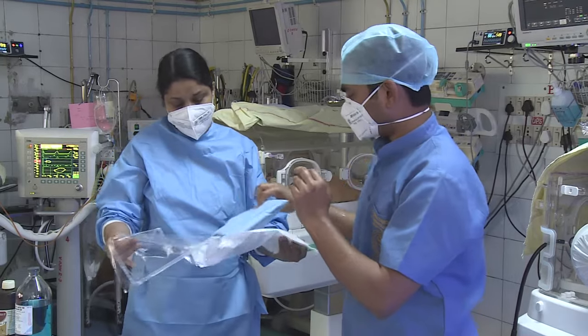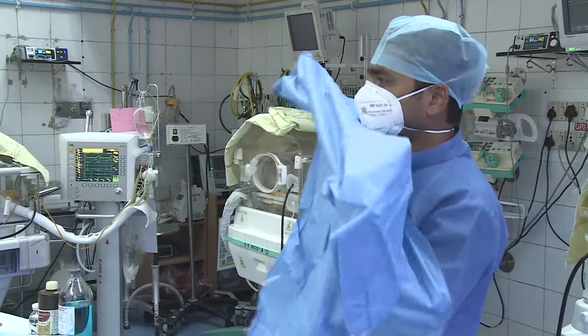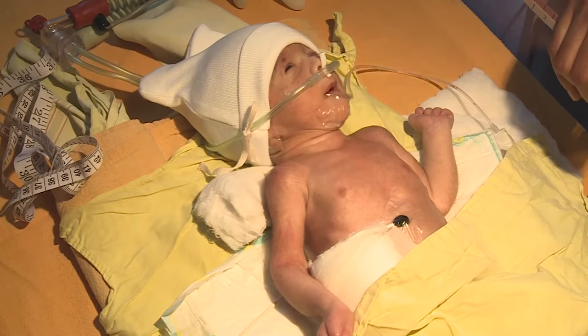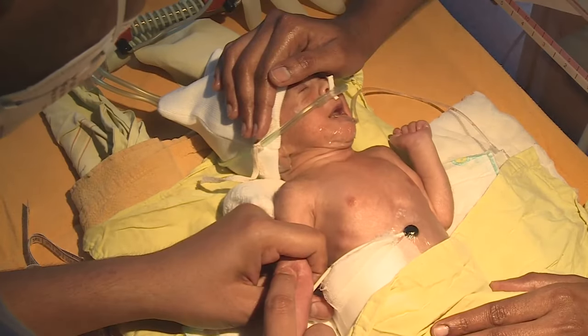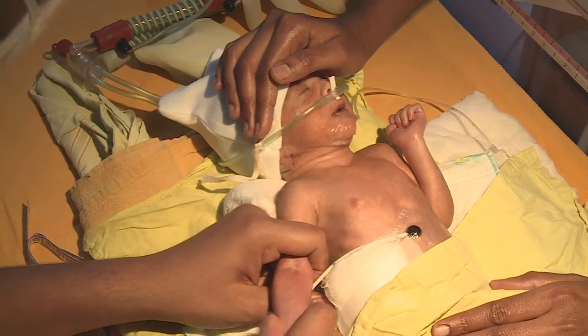A measuring tape and iris forceps are also needed. The commercial kit contains the catheter, a measuring tape, and breakaway needle. It is important that the personnel performing PICC insertion wears a cap and mask, performs a surgical scrub, wears a sterile gown, and maintains a sterile field.